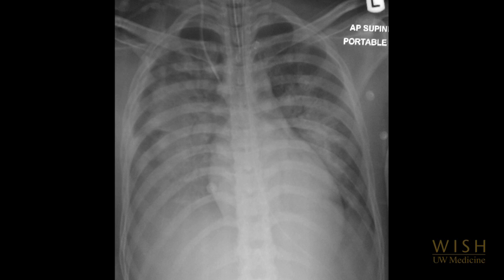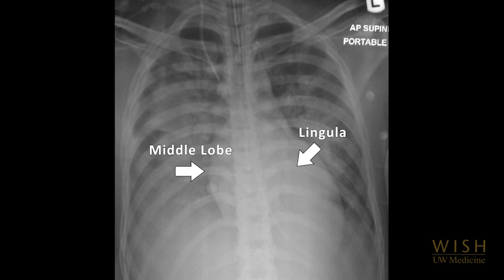If no specific area can be defined, which can be the case with diffuse parenchymal processes such as ARDS, the BAL can be directed at either the middle lobe or the lingula.